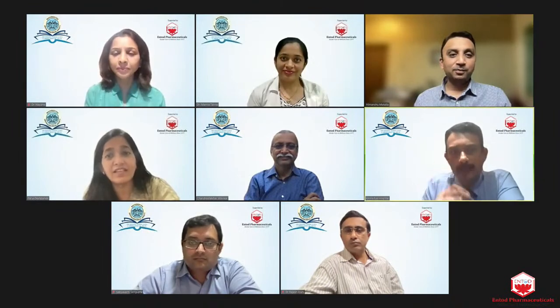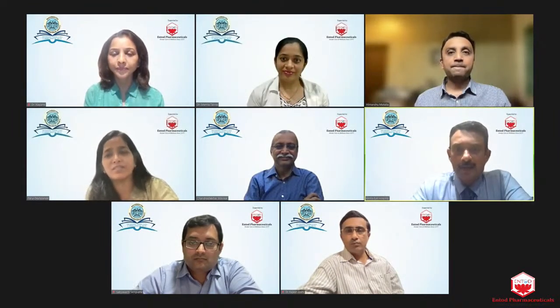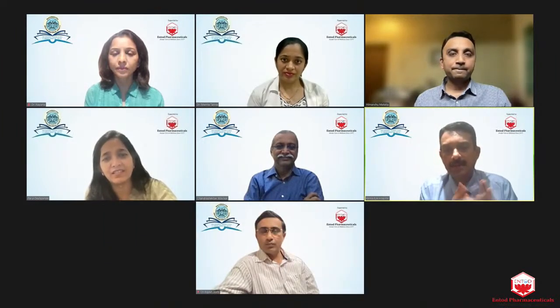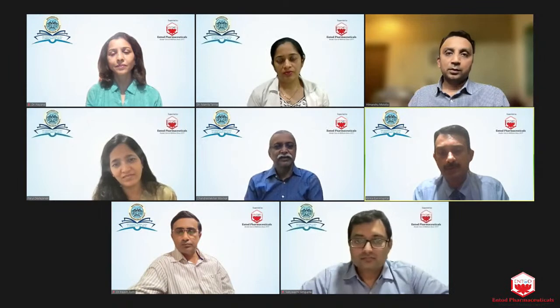So can I add a point here? Dr. Vivek. Yeah, Himanshu, you brilliantly cited the point to differentiate between a centered cone and a decentered cone. But would you think about measuring the posterior K value also? Because the refractive index which we are taking is 1.3375. We are not taking into account the posterior K value, which has already changed and would be asymmetrical. So with the IOLMaster today or with Scheimpflug cameras, if we could measure both of them, does it matter in any way?